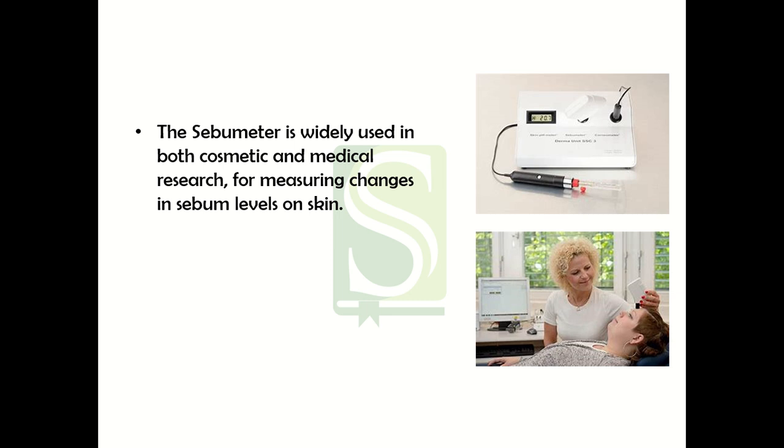Sebum is produced by your oil glands, sebum glands, which are present on your skin surface. It affects the permeability of skin and also affects the absorptivity of water. It protects against bacteria and fungi and limits absorption of water, and also affects permeation of drugs and other preparations. So measurement of natural presence of sebum on human skin is very important, especially on facial skin.